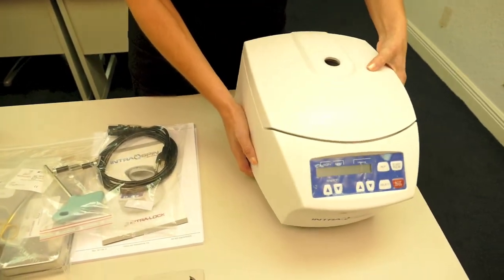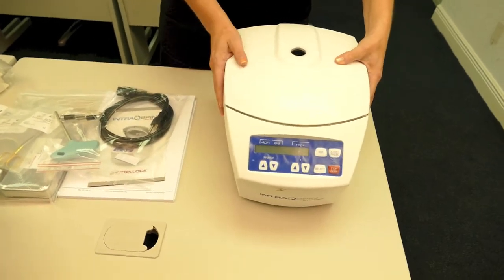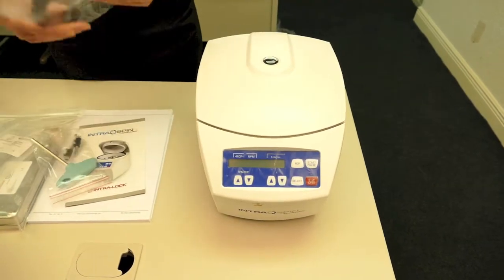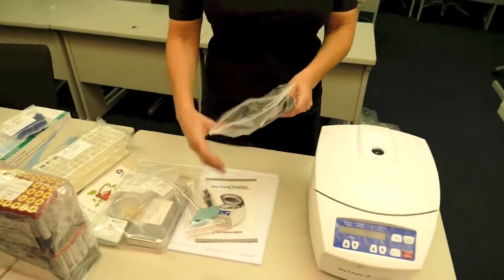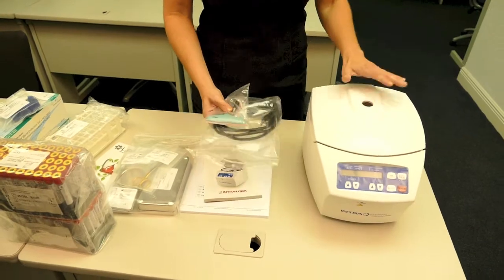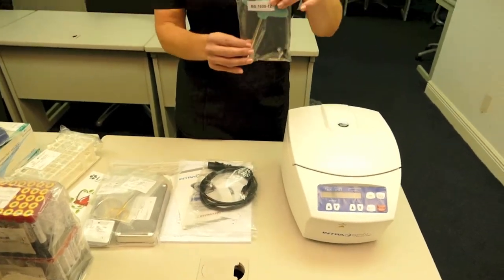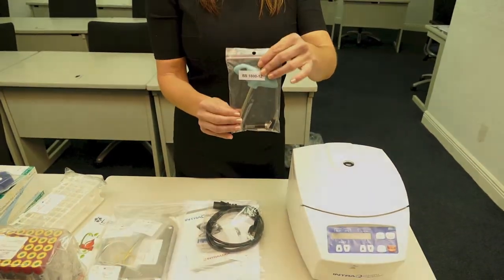Again, you want to be sure to place the centrifuge on a sturdy, flat surface. This is your power cord, centrifuge, again, two fuses, two bolts, and your hand wrench.